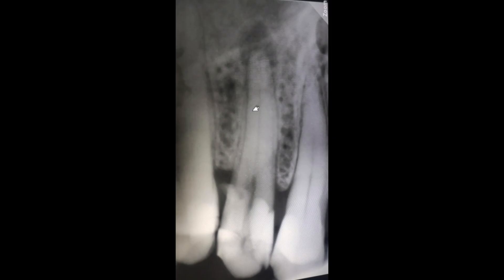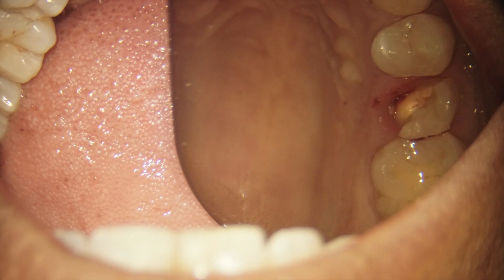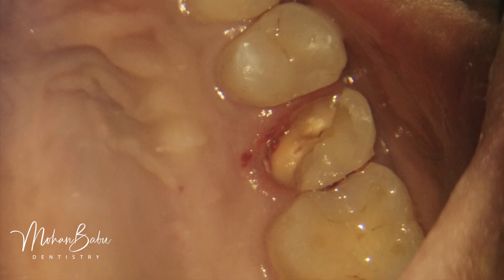This is a case of an upper right second premolar tooth which had a periapical lesion and very large restorations in the mesial and distal aspects. The patient reported to our clinic with a fractured palatal cusp. The palatal cusp had broken along with the mesial restoration, and the tooth had very little remaining structure.